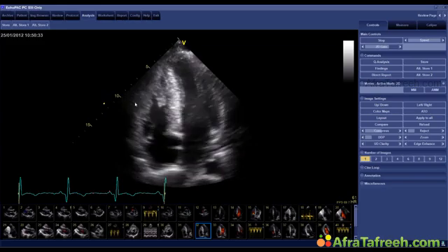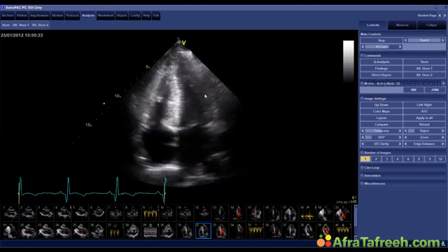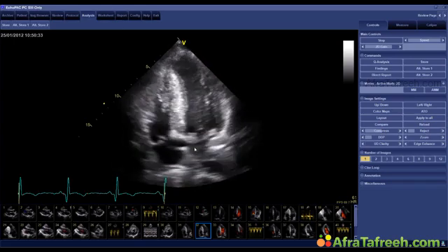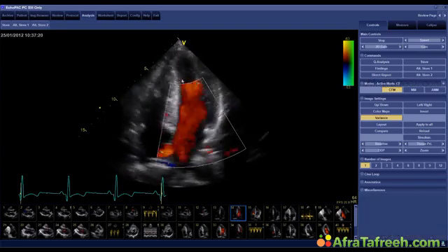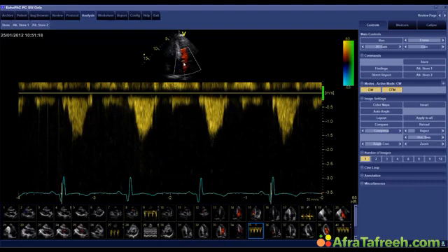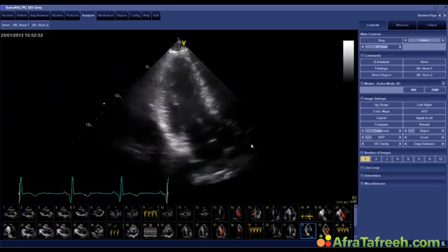But what is very important to see here is that the septum is very thick, and that we know that from the echocardiogram we can also estimate, or at least find clues which show, an increased risk of sudden cardiac death. And one of these risks is a thickness of the septum greater than 30 millimeters. So if you have these patients, always take a close look at the thickness of the septum. Another thing you should take a look at is, do the patients have obstruction or not? There are 2 sites of obstruction that one could find in patients. One is here close to the apex, and the other one is here in the LVOT. In this patient, we had a normal velocity both in the LVOT and in the ventricle, so this was a non-obstructive type of cardiomyopathy. But certainly this does not change his elevated risk for sudden cardiac death.